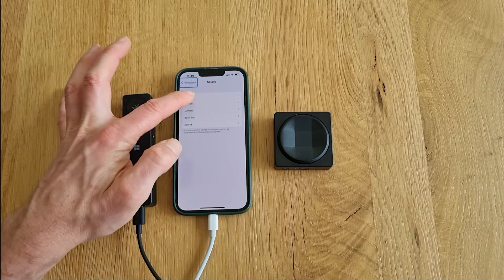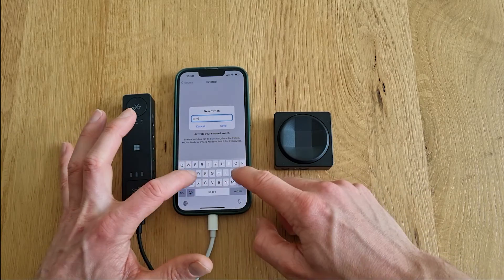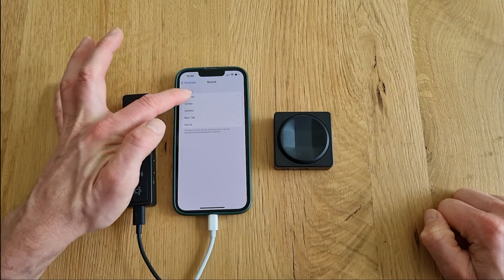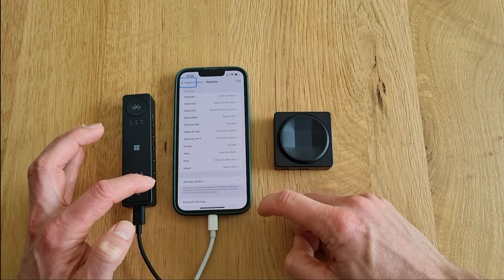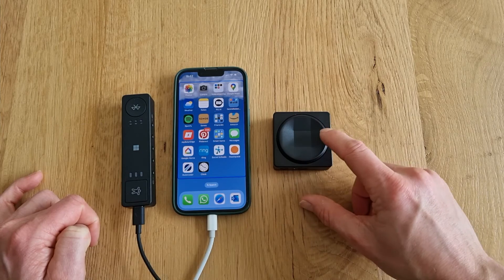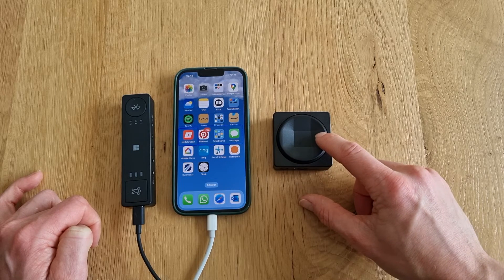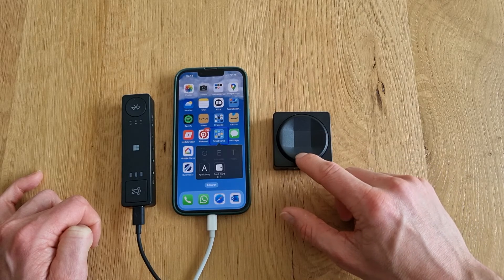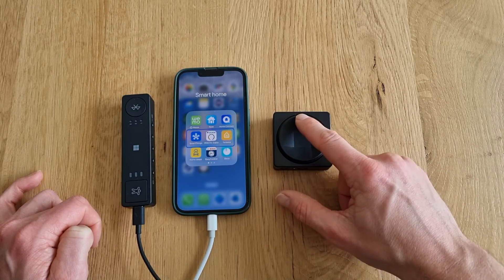The d-pad itself already offers a lot of input options, so let's assign a few more. D-pad left to open the Scanner menu, and d-pad top-left for Escape. I now have quite a nice navigation mechanism with this one d-pad — I'm only using a few of its functionalities, but you can obviously design it completely to your preferences. Maybe add a trigger for voice, and being able to control your smart home through the phone, this can offer a lot of opportunities.